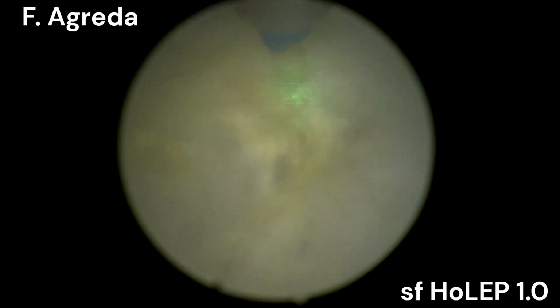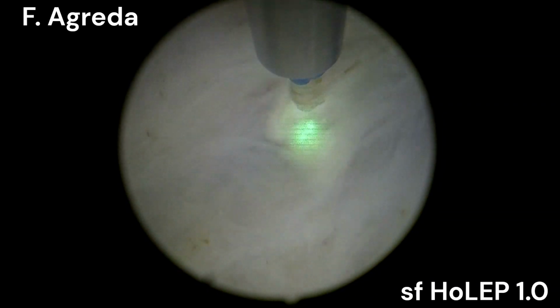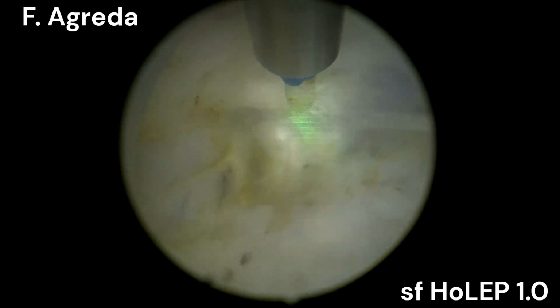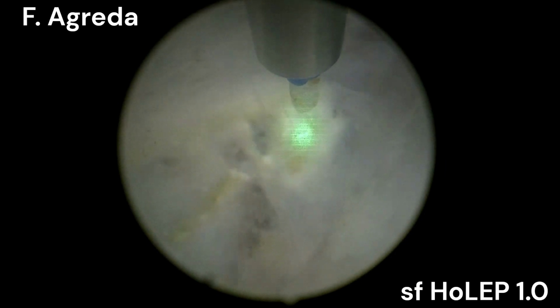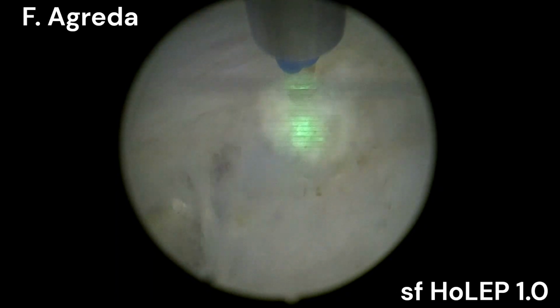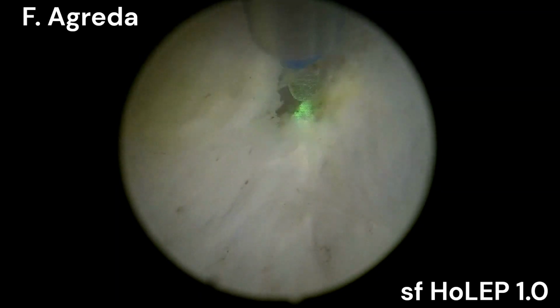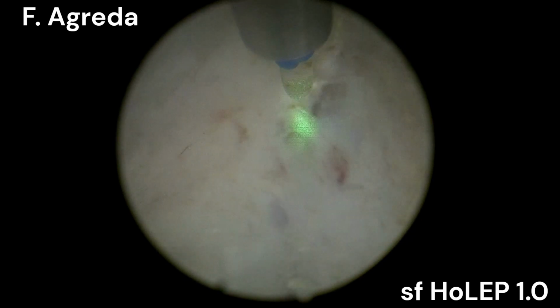And even when you're progressing in an upwards direction, you have to keep in mind that when you lift the prostate, there's no water over here, when you lift the prostate, the capsule is also lifted. So if you go pointing a little bit downwards, you can do a perforation of the capsule. But if you keep that in mind, you go in a very progressive and controlled manner, there should be no problem.